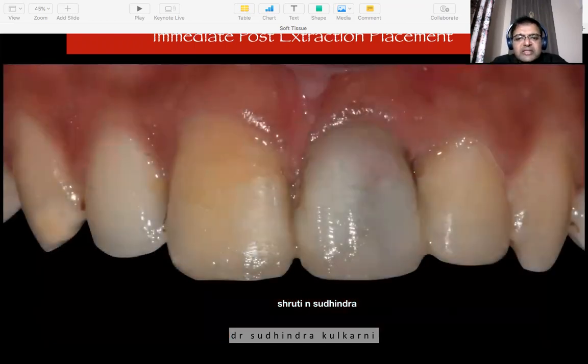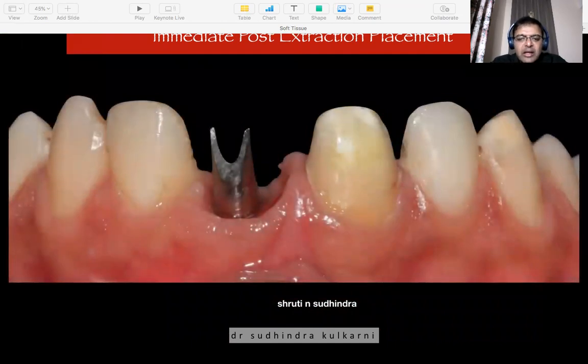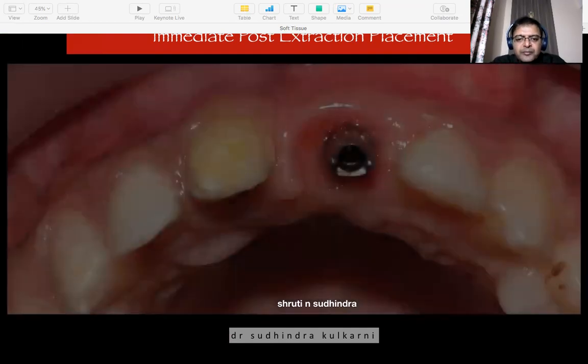Go ahead and temporize it. As the connective tissue matures and bulks up as it heals, you start seeing beautiful healing around the temporary restoration. This temporization process was probably for around 3 months. And now, by the time you come to do a final restoration, you see beautiful soft tissue around this abutment.